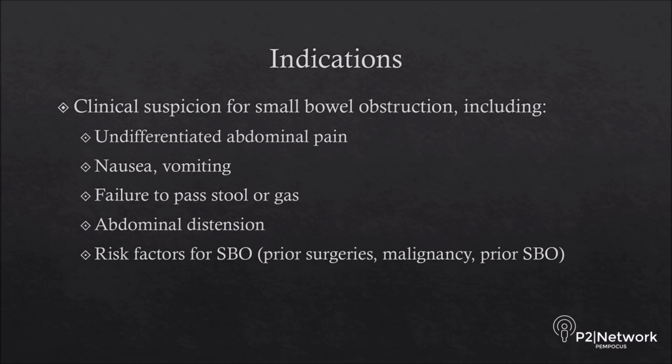You should use point-of-care ultrasound anytime you have clinical suspicion for a small bowel obstruction. This includes patients with undifferentiated abdominal pain, nausea, vomiting, failure to pass stool or gas, abdominal distension, or any risk factors for SBO, including prior surgeries, malignancy, and prior small bowel obstructions.